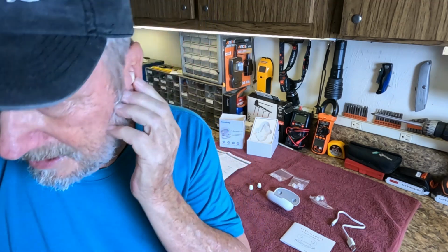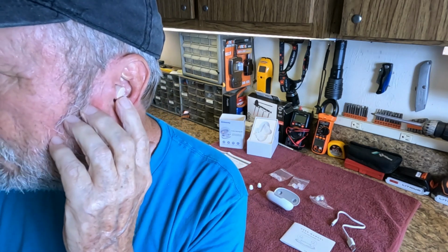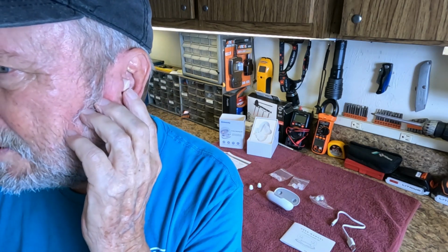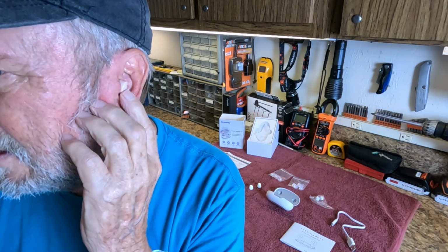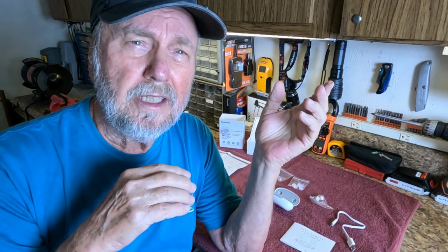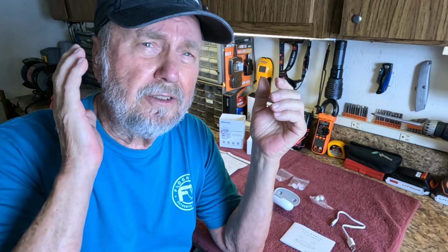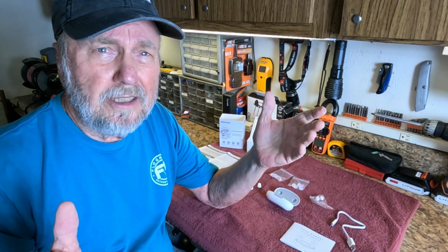Now this one I'm going to see what it is. Let me go around. Okay. 1, 2, 3, 1. Okay, they're both set at 1. Now your hearing may be different in each ear, so you may want 1 in the left ear and 2 or 3 in the right ear. So you adjust it to where it works the best. That's all the adjustments you need.